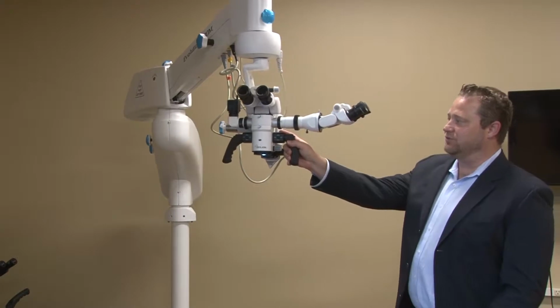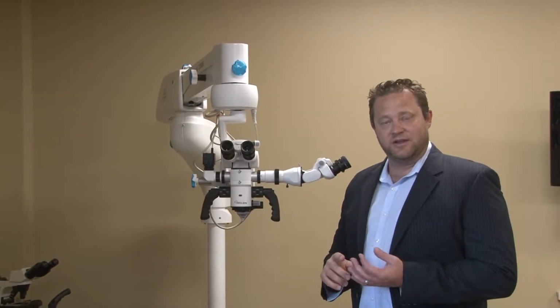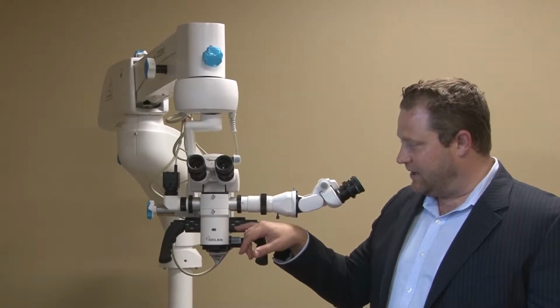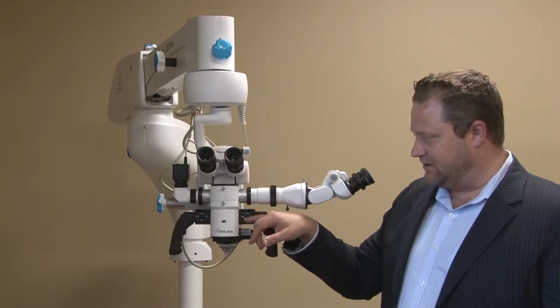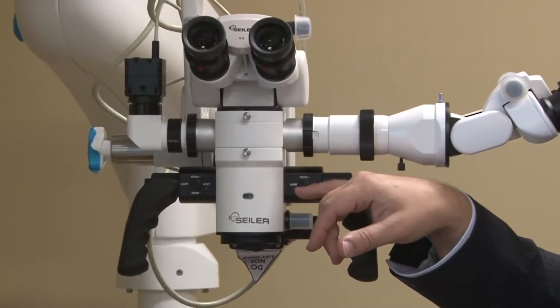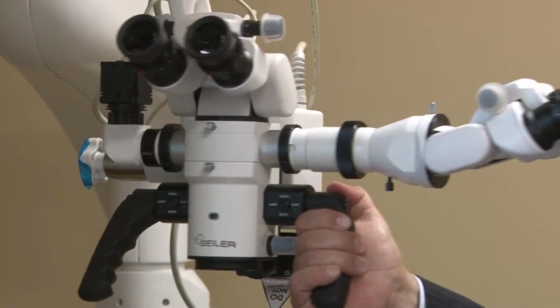With the new zoom, the doctor has the functionalities of controlling the motorized zoom, motorized focus, and the light via hand control. So right here on your right side, that's going to be your focus mechanism. Down and up. You can control the illumination. Right now we have an LED light source.